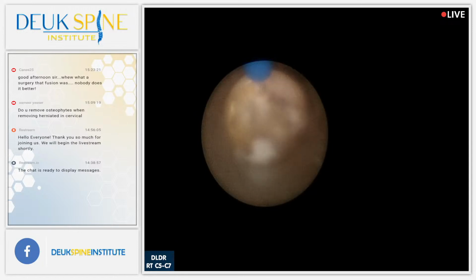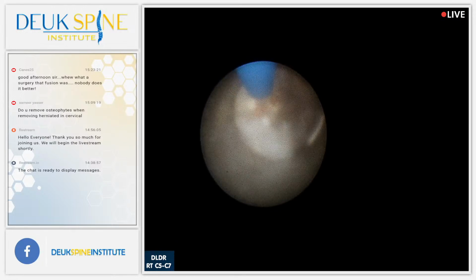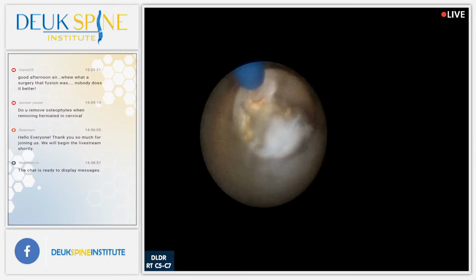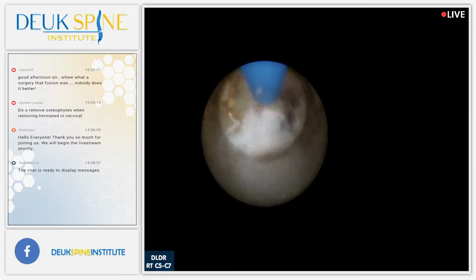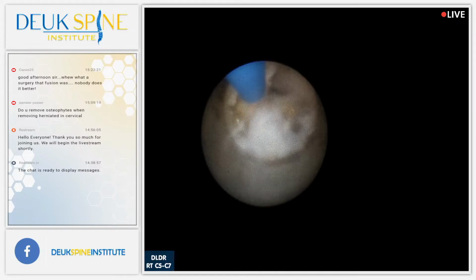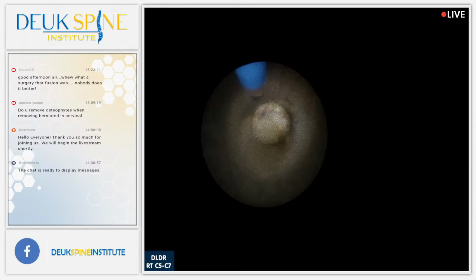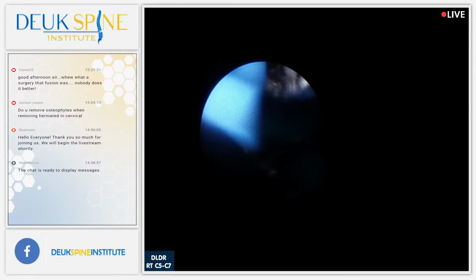Yeah, almost. So scarred. Look at that. That's the hardest I've ever worked to get a herniation. I think that's the hardest Luis has ever worked. Am I right, Luis? Yeah, you're right. Let's have a grabber. I want to see if I can grab some of that right there. That's a herniation for sure.